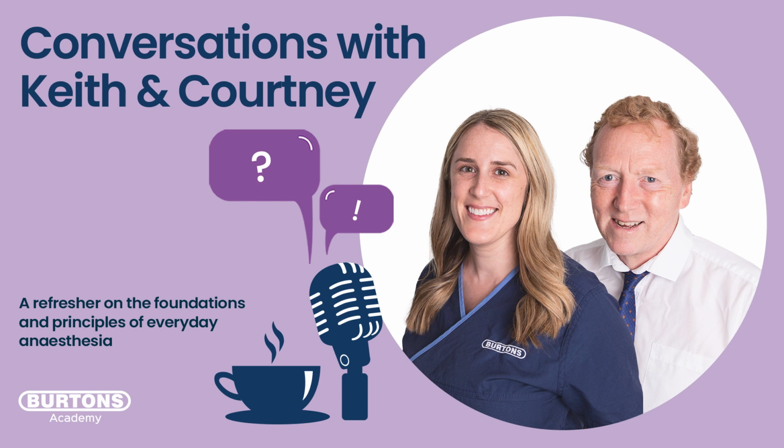So again, keep it simple and stick with 1 second. And between basically 5 kilos and 45 kilos, you're not going to go wrong. And outside of those limits, you're going to need to just change it as we go. But if you're unsure, inexperienced, start with 1 second. Okay? Because you and I breathe in about 1 second. Yeah. Dogs and cats breathe in about 1 second.